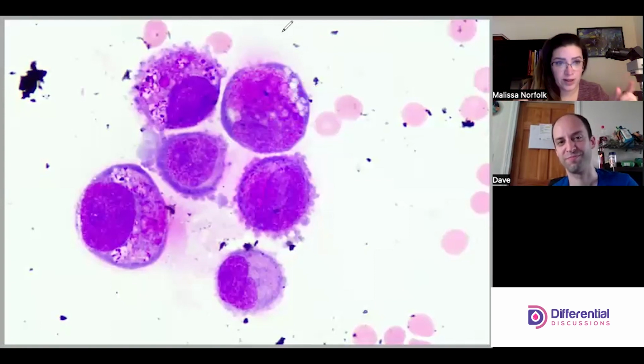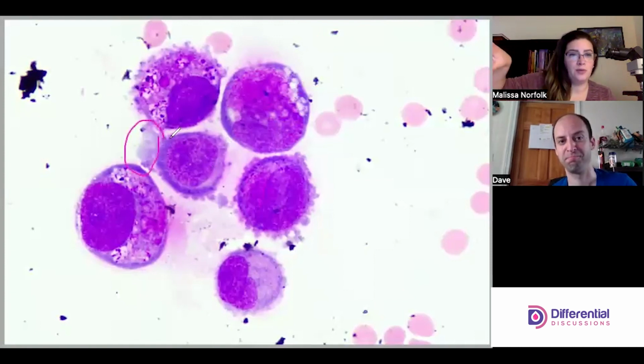So these have blebs also, but they are not nice, normal looking blebs like you would expect to find when you're looking at a lining cell. Look at this bleb here. It's almost like trying to bloom out the way a megakaryocyte would, pushing out some kind of platelet, or like a giant platelet would with pseudopods. And these are not megakaryocytes or anything related to that.